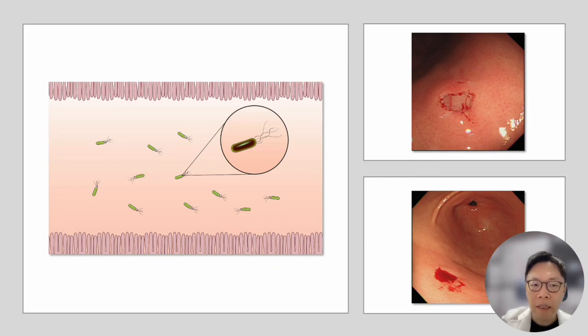Moreover, it has been reported that a large number of samples increase H. pylori detection. But I disagree with this suggestion because mucosal damage and oozing of fluid occur during sampling. As H. pylori is a non-invasive bacterium dwelling in the mucous layer, swimming in the surface of the stomach, why not sweep it up and contain it?